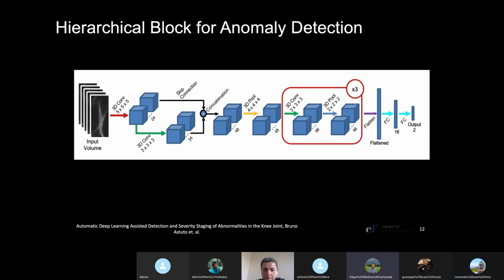Yes, my question also is related to the architecture. Have you seen the new modules like squeeze and excitation blocks or EfficientNets? Because probably the new tools can be added in the middle. Skip connections usually come from DenseNet, and this is one of the reasons it works, for example, in vanishing gradient and normal problems in deep learning. But probably the new blocks can give you more improvements. Have you tried with some of them?